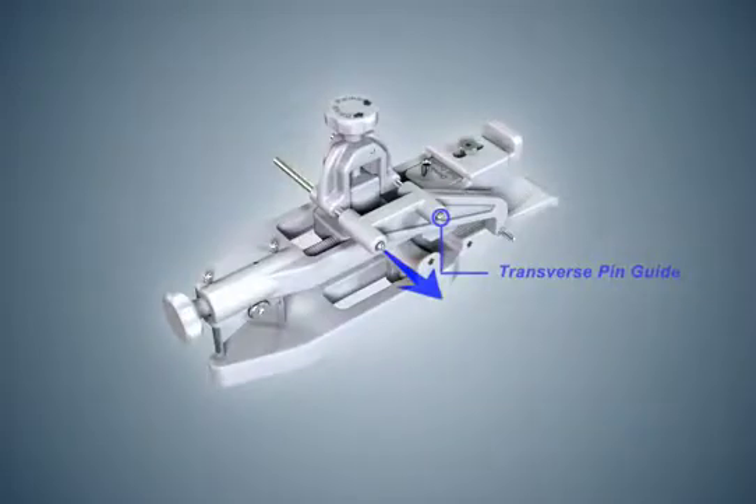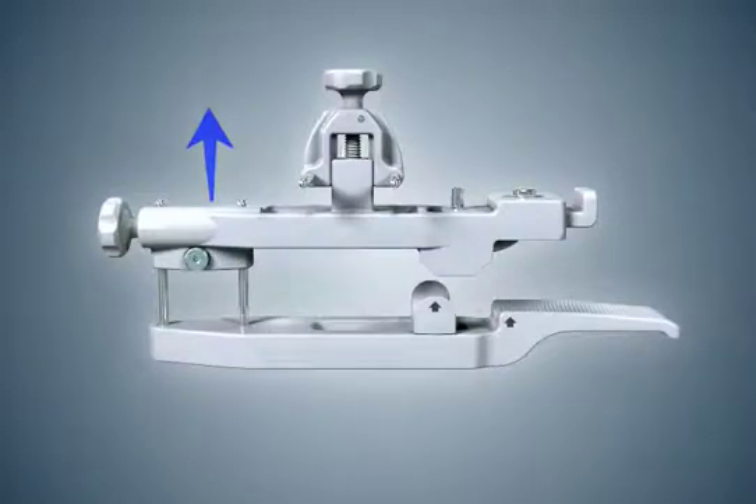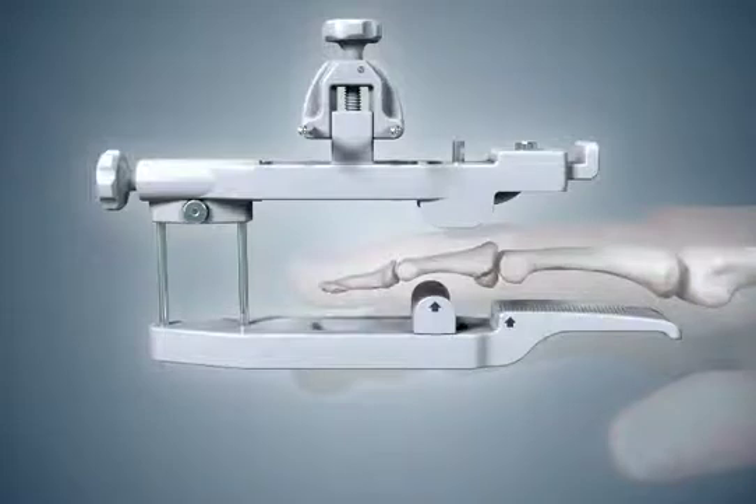Remove the transverse pin guide from the pin placement guide and loosen the distal lock screw with the hex wrench. Slide the dorsal and palmar halves of the pin placement guide apart. Place the finger onto the palmar base. The palm of the hand must be parallel with the palmar base. Do not align the fingernail with the palmar base by rotating the finger. Position the finger with the PIP flexion crease aligned with the proximal arrow on the palmar base.